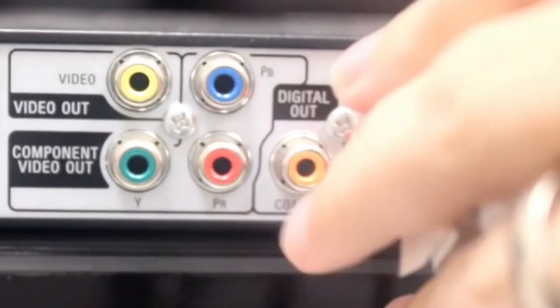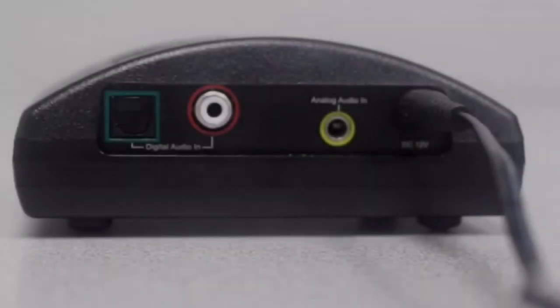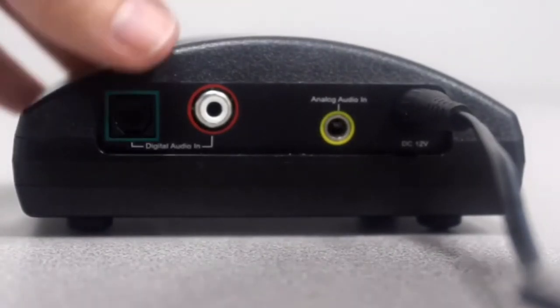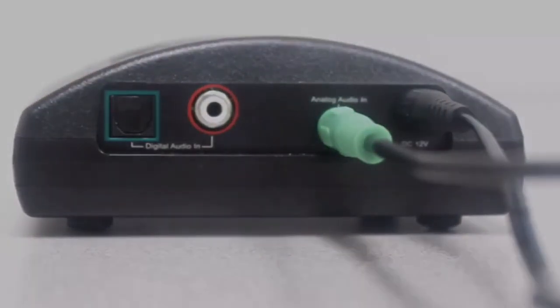Once you've located the ports, plug the red into red and black into white. The other end of the RCA cord, which is green, needs to go into the back of the TVEARS transmitter. Look for the yellow circle labeled as analog audio in, and plug it in tightly.